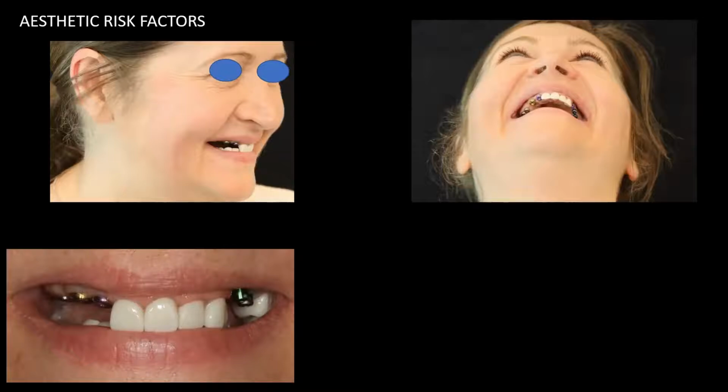And so the problem is patients presenting in a practice where the dentist promises that they're the guru in implants, like the old saying, I can teach a monkey how to cut a bone and place an implant. Is that clear? But I can't teach a monkey how to finish the case. So this case is an aesthetic failure.